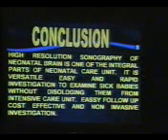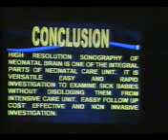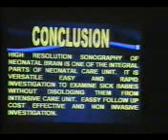So, just to conclude, high resolution sonography of the neonatal brain is one of the integral parts of the neonatal care unit. It is a very versatile, easy and rapid investigation to examine sick babies without dislodging them from the intensive care unit. Easy follow-up, cost-effective.